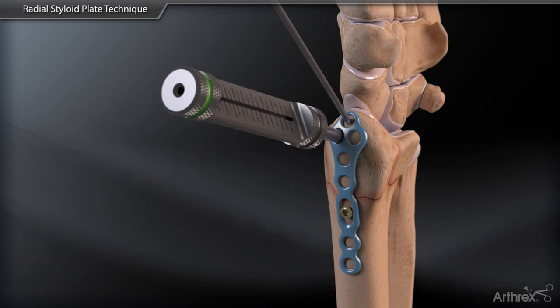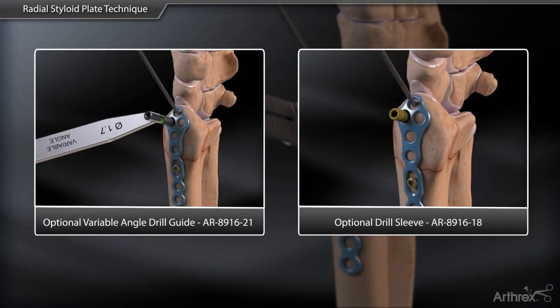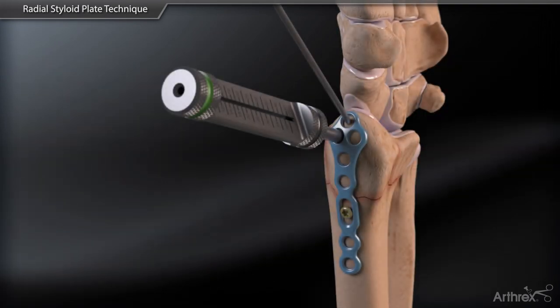Use the threaded locking tower, variable angle drill guide, or short drill sleeves to drill and place the 2.4mm variable angle locking screws into the remaining screw holes.